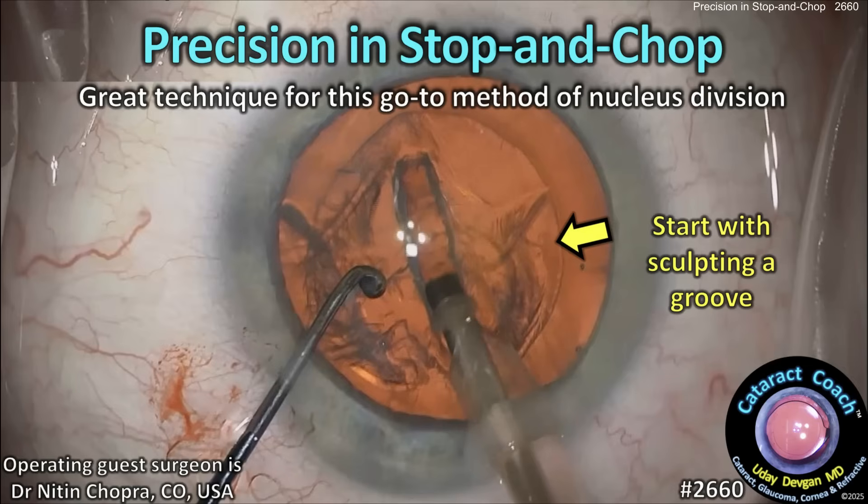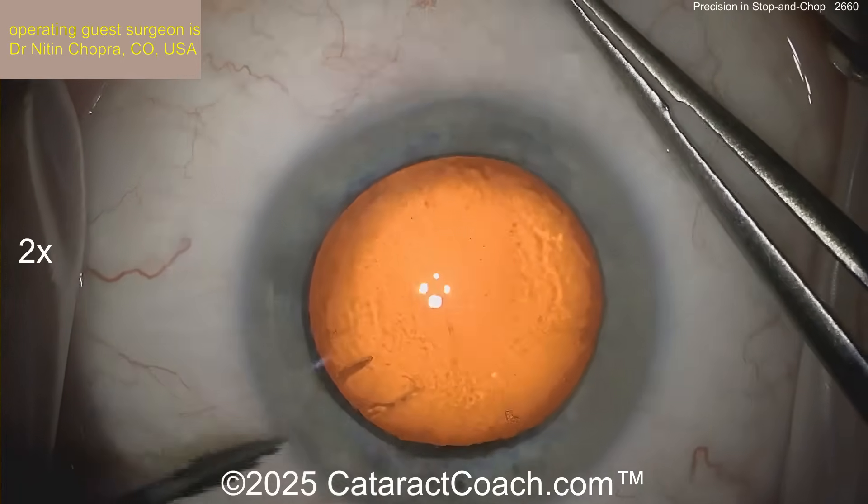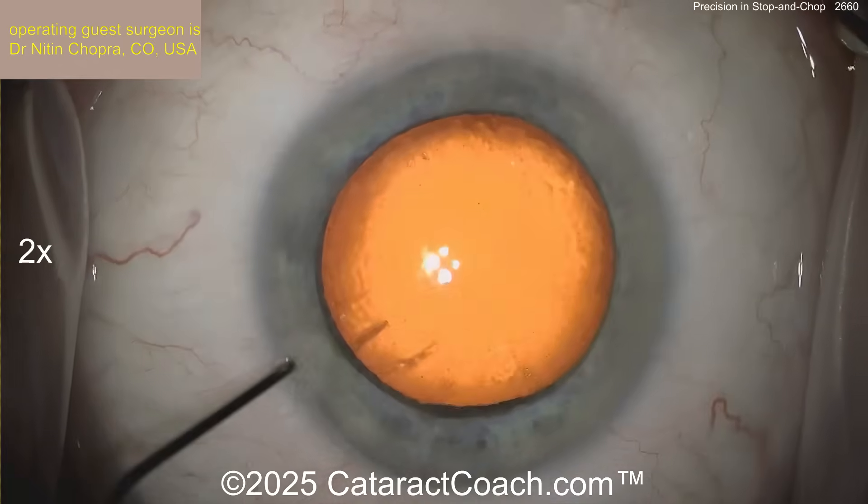Got her at Coach.com. Precision in stop and chop — it's a great technique for this go-to method of nucleus division. Our guest surgeon here was on our podcast yesterday. That's Dr. Nitin Chopra from Colorado, here in the USA.